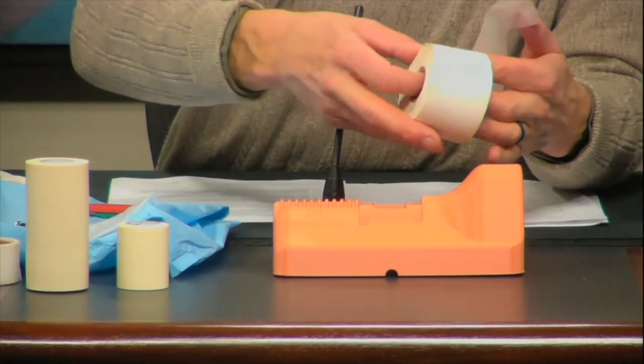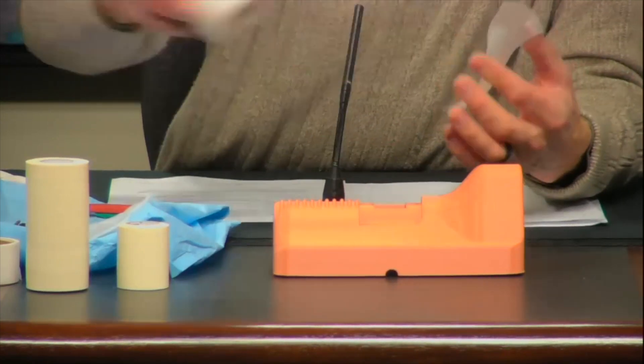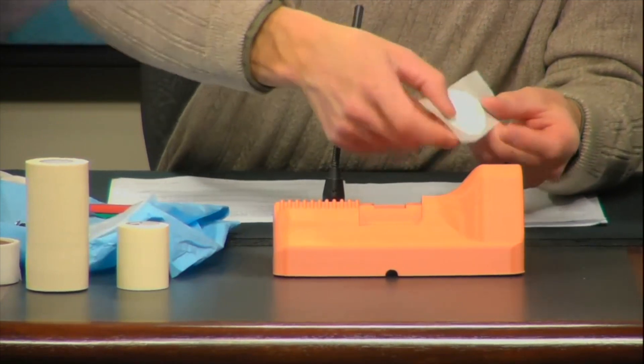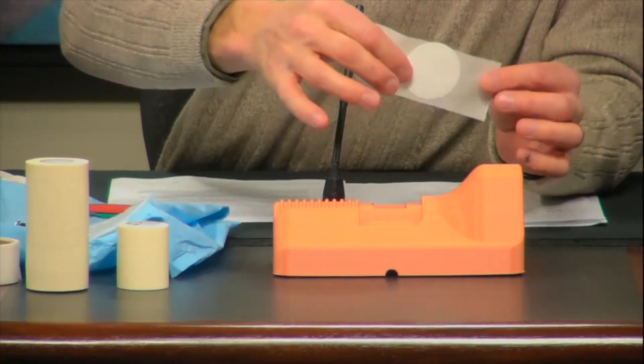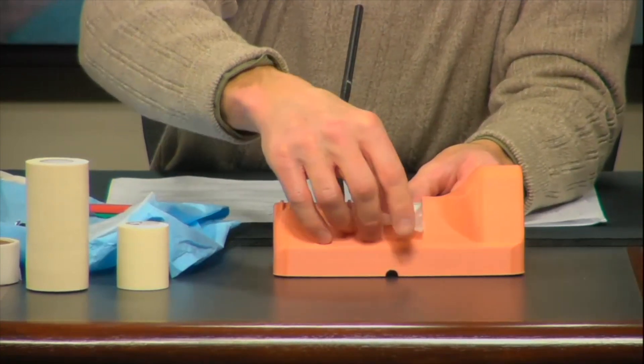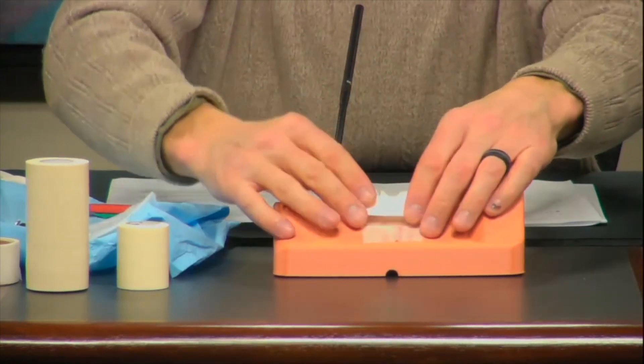We use stickers for the backing — you get a very large roll with thousands of stickers, pretty cheap — and put that on the back in the center. I'll show you the purpose for that once we get into the procedure. That goes over the opening, and then we replace the cartilage overlay unit.